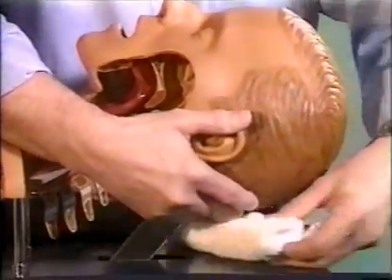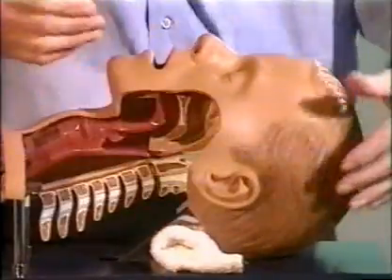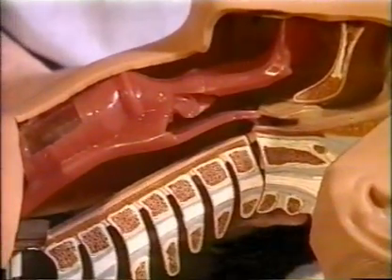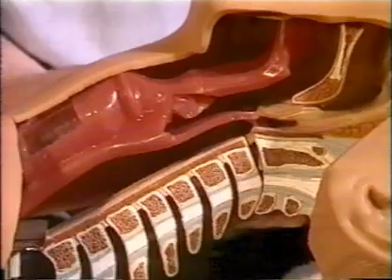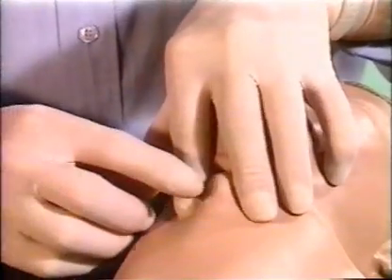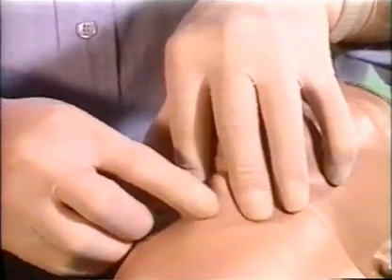Hyperextension of the head stretches the skin of the neck and facilitates the identification of the laryngeal structures. Two fingers steady the larynx while the index finger palpates the site of the puncture — the cricothyroid ligament.